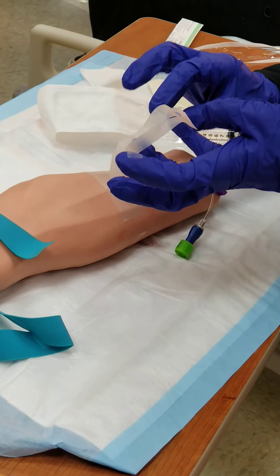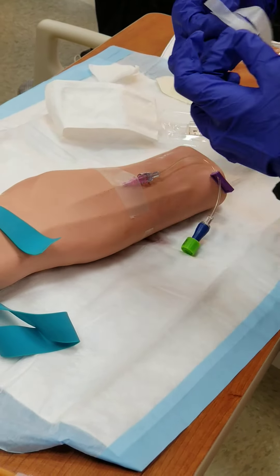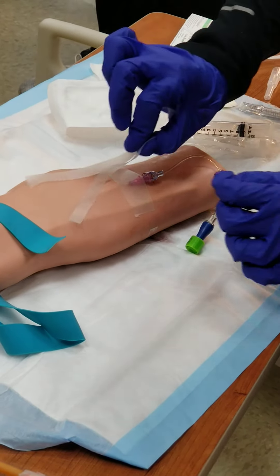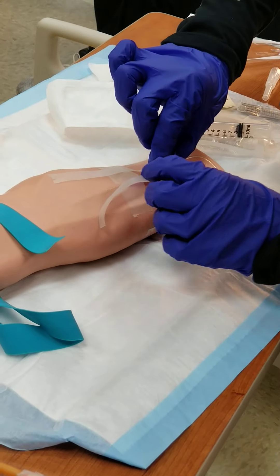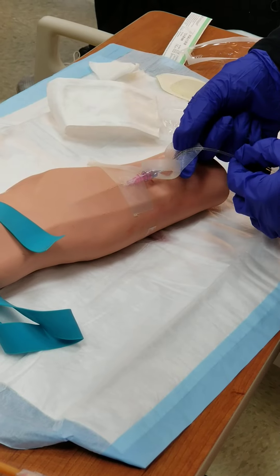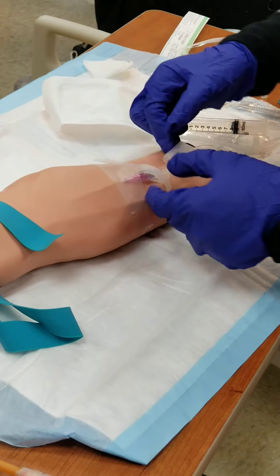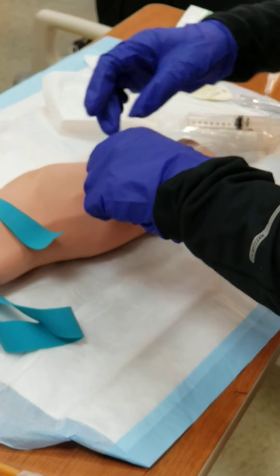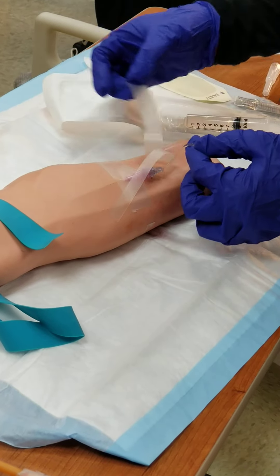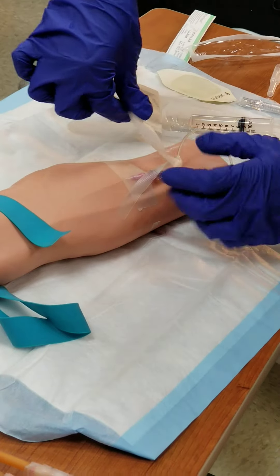Sticky side down and folded up. Once you get used to a certain thing, you get out of practice on these others. And then it crosses. The important thing is — stabilize it, however. Just make sure it's in there and stabilize. You can get it in and out of there, so you can unplug it and plug it back.